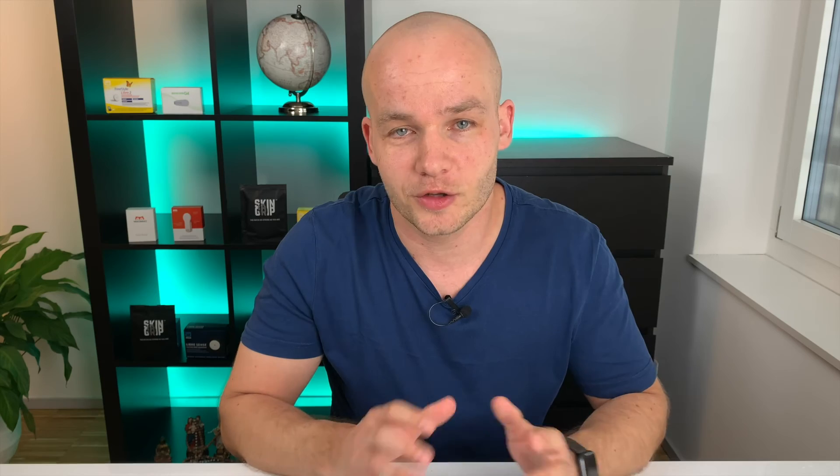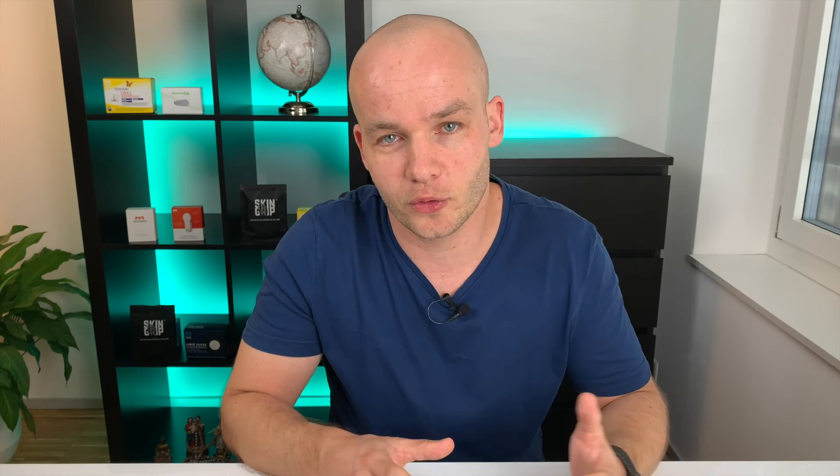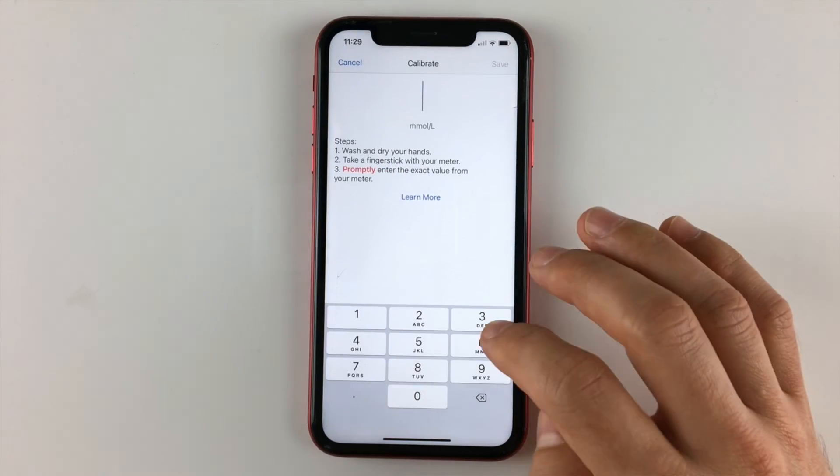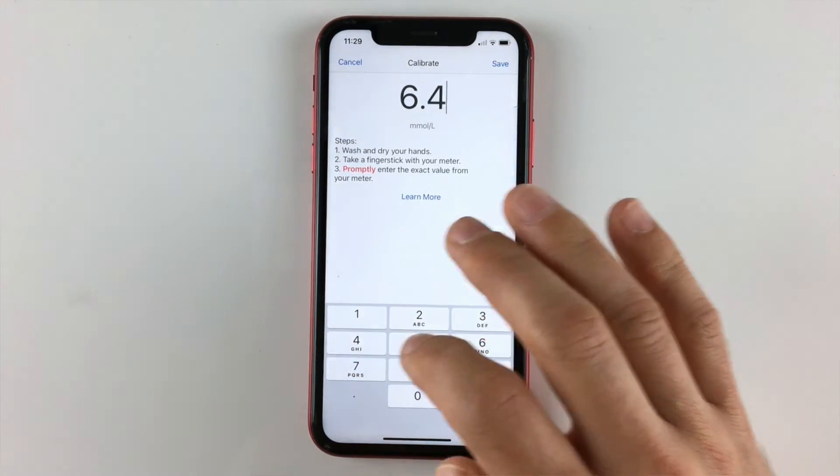Next, click 'Start Sensor.' It will take two hours for the new sensor to warm up, and after those two hours you will start receiving your blood glucose data and alerts on your G6 app. The readings will update every five minutes via Bluetooth, as long as you keep Bluetooth on and keep the G6 app running in the background. If you close the app you will lose the alerts, so let it run in the background. You don't need to calibrate the Dexcom G6, but you can — I'll make a separate video about how to do it.